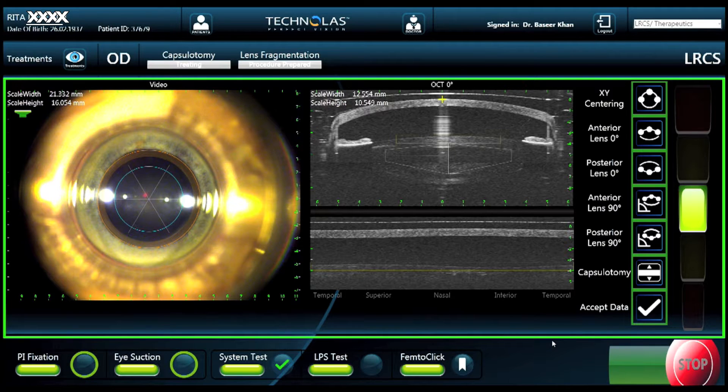After a few seconds, you'll start to see the bubbles coming up as the laser is delivered to the capsulorrhexis. This only takes about four seconds. There is a brief delay as the computer switches over to the algorithm for lens fragmentation. The laser delivery pattern is indicated by the white lines. The circle represents the capsulorrhexis, which is five millimeters in diameter. The six radial cuts represent the fragmentation and are approximately six millimeters in diameter, extending beyond the capsulotomy.